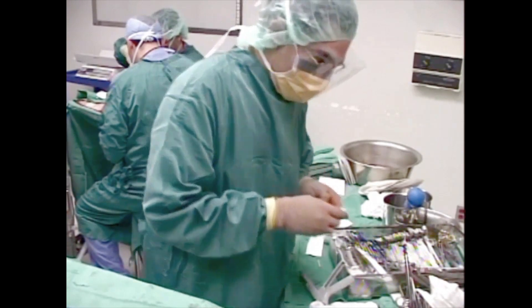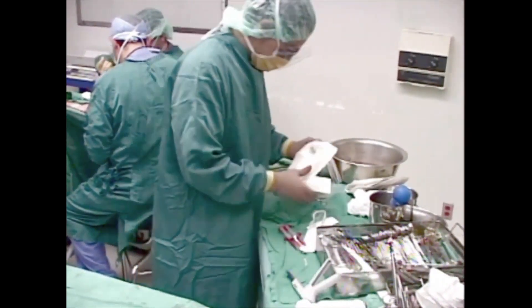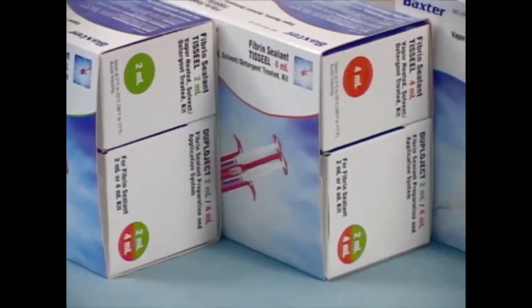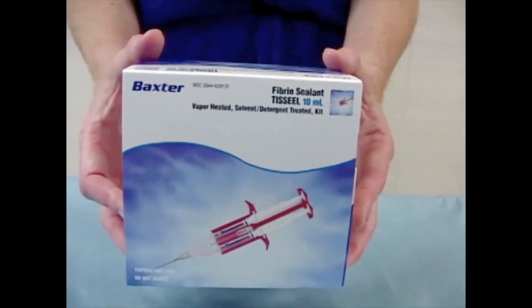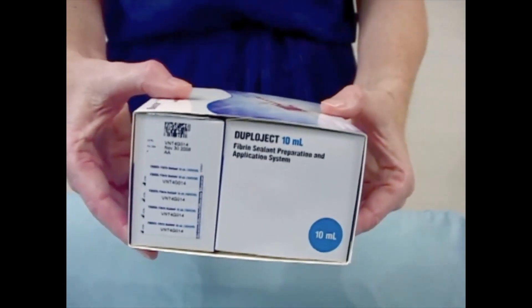This video will help guide you through the steps to prepare your Tisseal Fibrin Sealant Lyophilized Kit for use before surgery. Tisseal Fibrin Sealant comes in three different sizes: 2, 4, and 10 milliliters. You can easily identify the product size by the labeling on the front of the package and the colored circle on the end of the box.